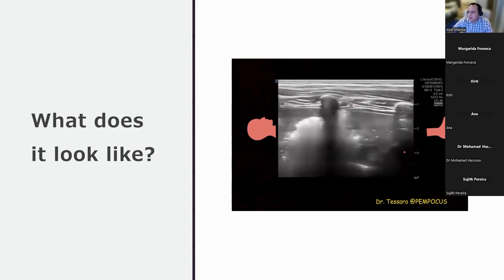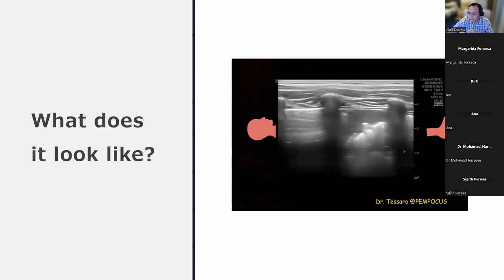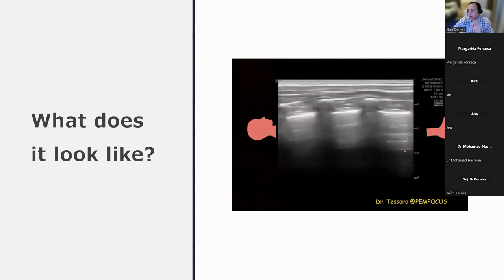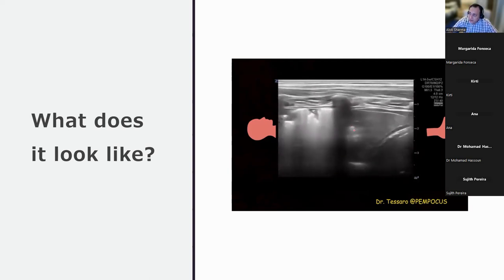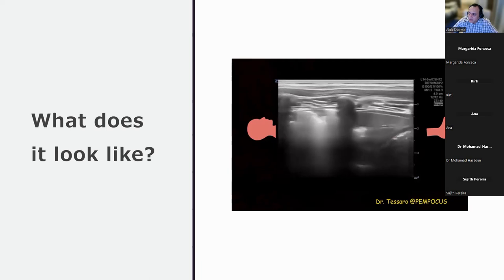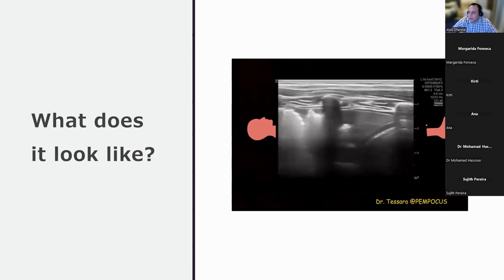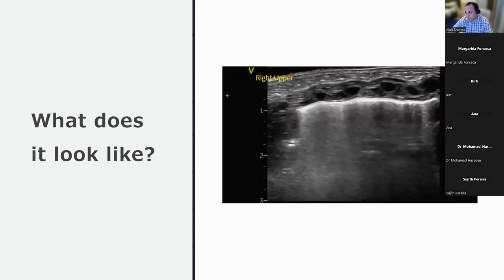So just be careful of terminology. And the terminology kind of is that you need to look at the area of atelectasis to be able to make a determination of whether air bronchograms are static or dynamic. Now, the reason you're seeing dynamic air bronchograms over here is because this area of lung is consolidated. And basically what you've got is a distal area of aeration from the consolidation into lung that is atelectatic. But actually, if you look at the atelectatic lung to the distal end, there are no dynamic air bronchograms going through it. So again, fixation on terminology and how you interpret things, you don't want to get too confused. Now, let's talk about this image.